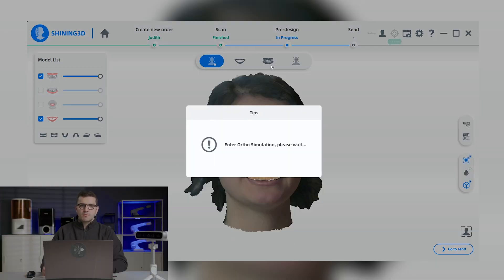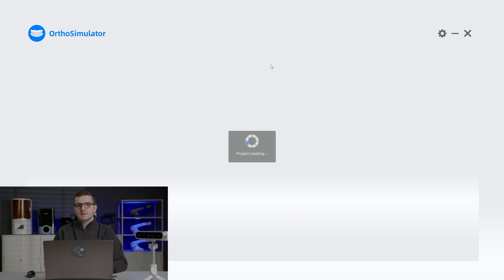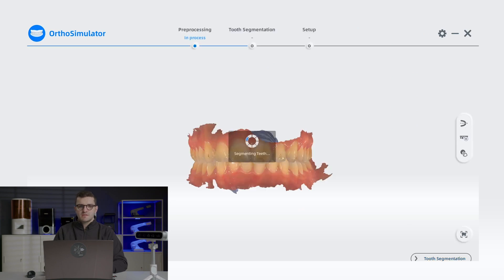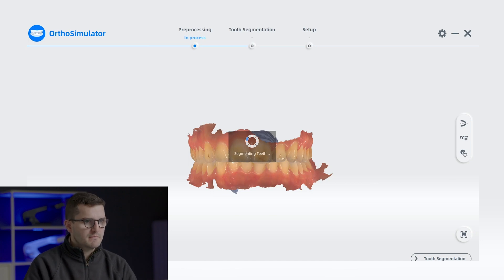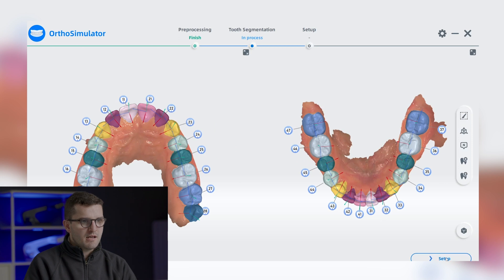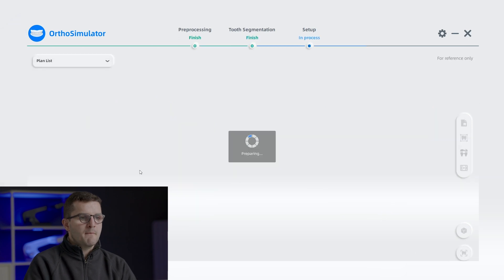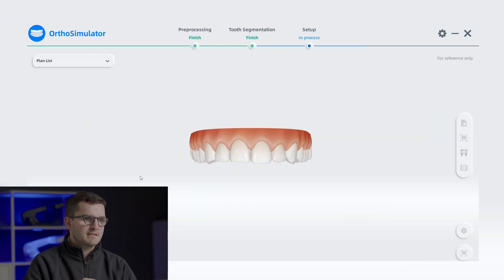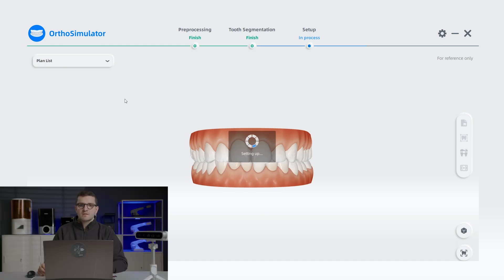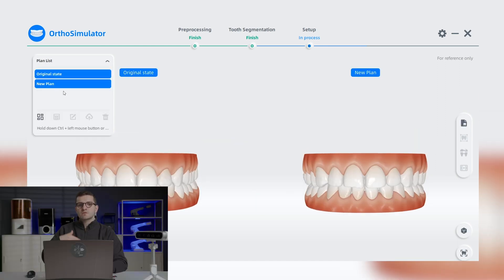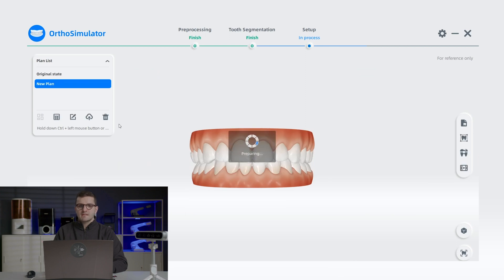Moving on to the next module, the ortho simulation is an updated version of the module available in the internal scan software, with the main features remaining the same. Clicking on the ortho simulation initiates the process and we start by automatically segmenting the teeth to identify their exact shape. Once complete, we can create a new orthodontic plan or make adjustments to an existing one.